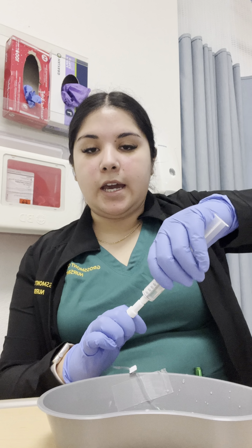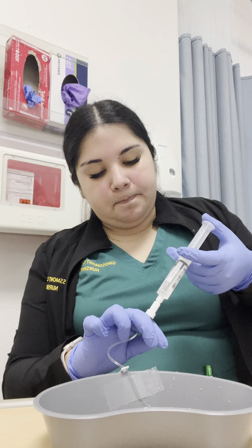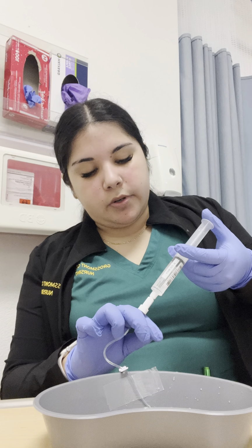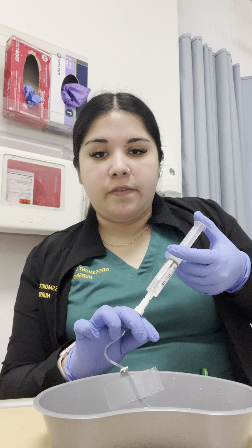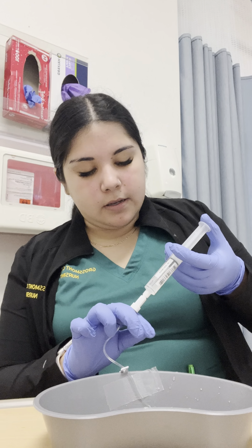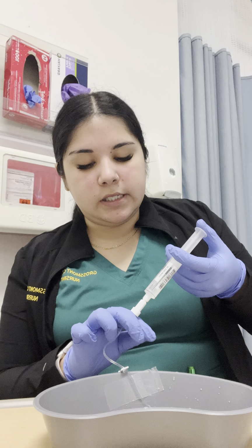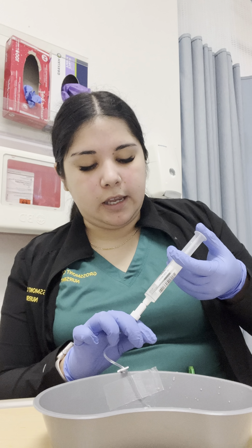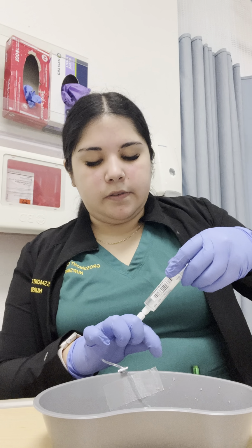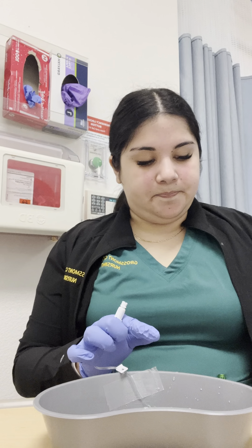And I'm keeping my cap in hand because I will be still using this. I'm going to draw back for blood. And I'm also going to push about 5 mLs. And this is just to ensure IV patency. It is flushing smoothly. I am not met with resistance and I do not see any fluid leaking. And once those 5 mLs are in, I will go ahead and cap my flush again.